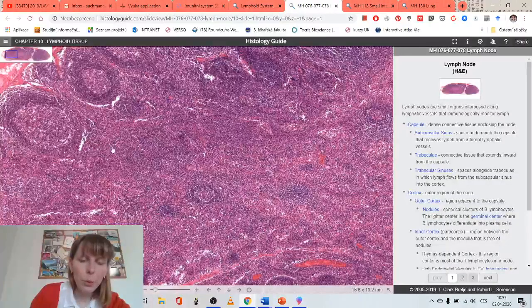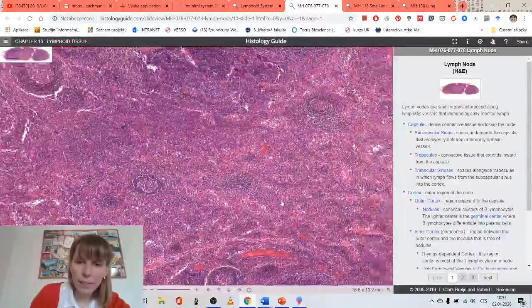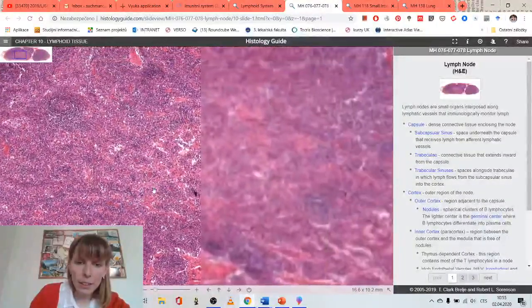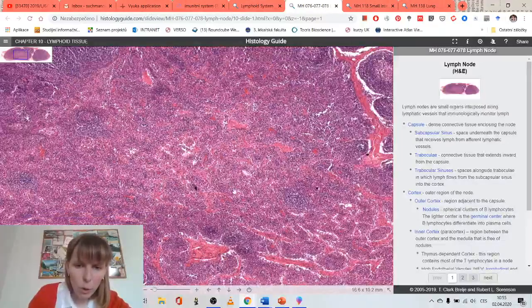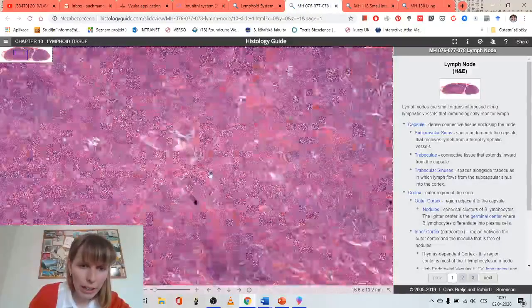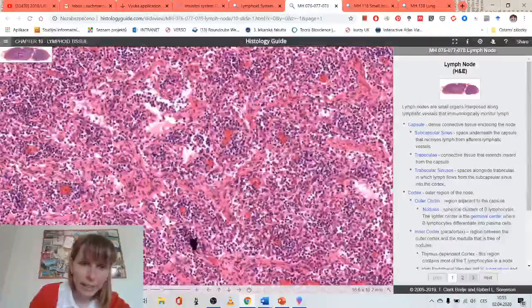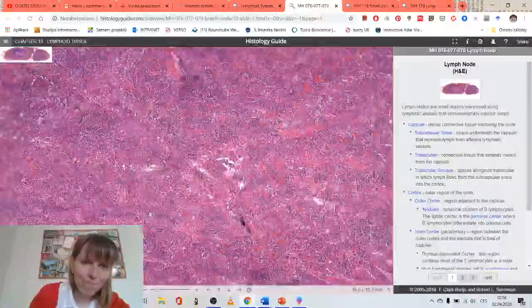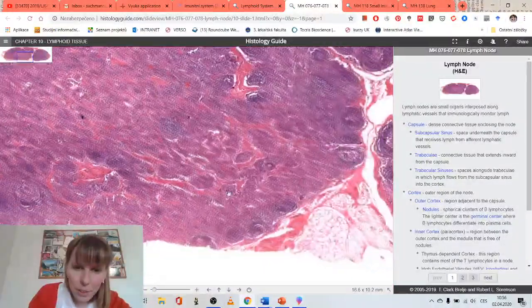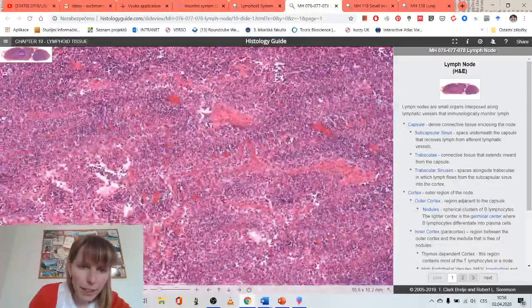This is where you will have the T cells. And finally, it will get into this part, which is more loose and more light if you take a look at it from far. And if we zoom in, not a very nice example, but anyway.